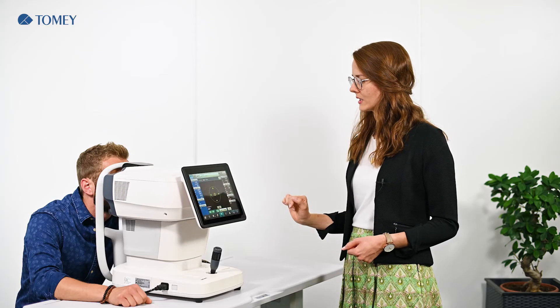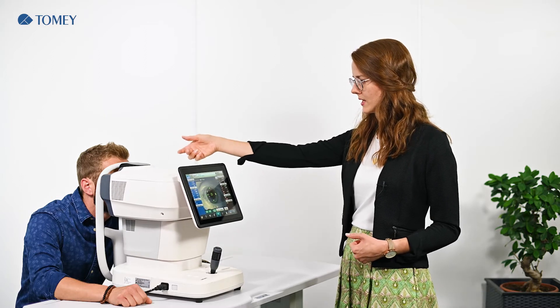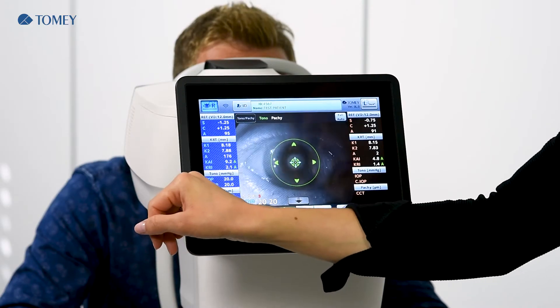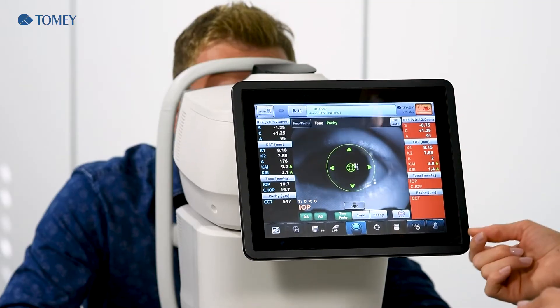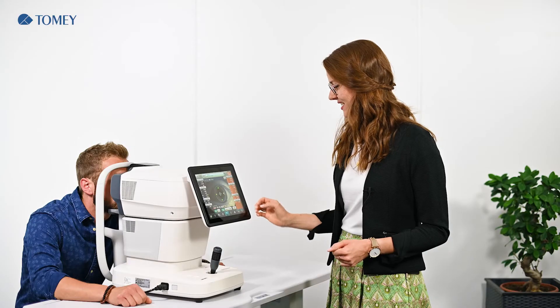Tono and paki uses another cone, so the cone in front of the device is rotating. In the first step, pachymetry is measured and afterwards we have the tonometry. For the tonometry, it is possible to choose between a single air puff or three air puffs.